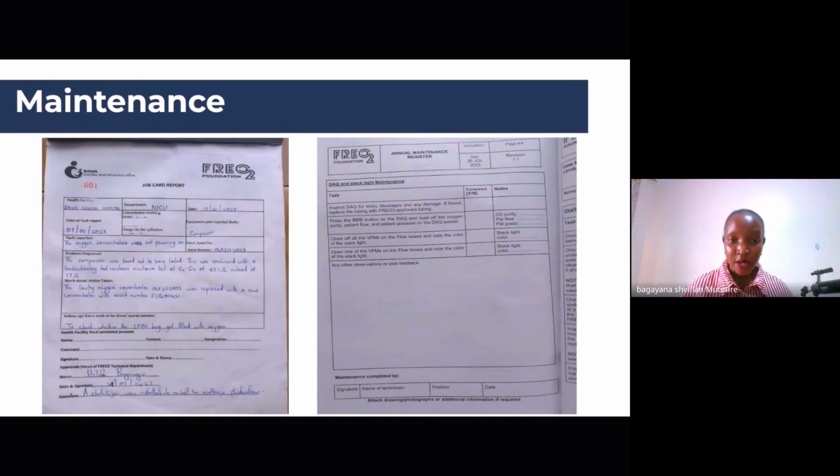We also have a section where we specifically include, say, if we're doing the 6 months maintenance, how to test for leaks, do this, and this. Okay, have you done it? Yes. Then comment, say, maybe I did this and it passed. So we integrate our guidelines with the actual register so that we know exactly what has been done and the exact spare parts that have been used.